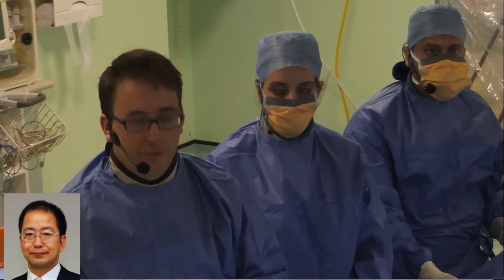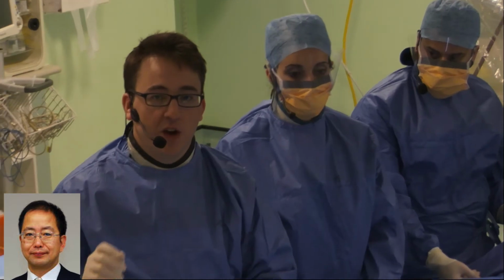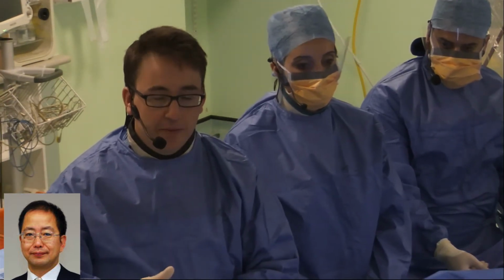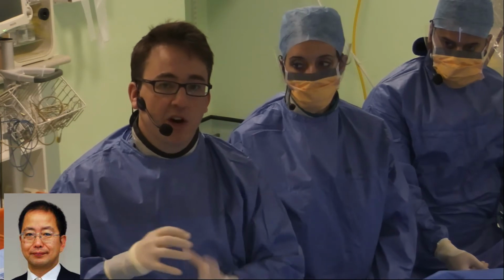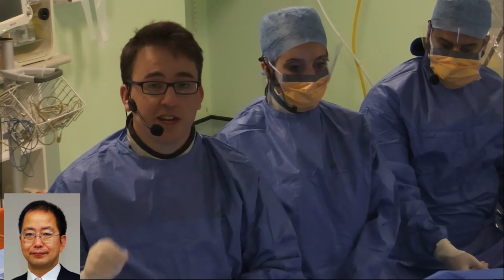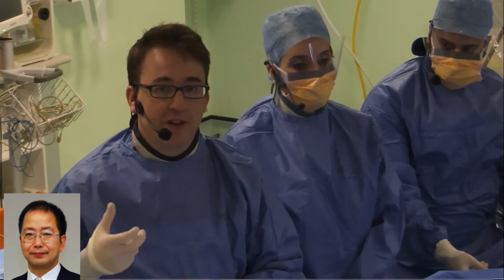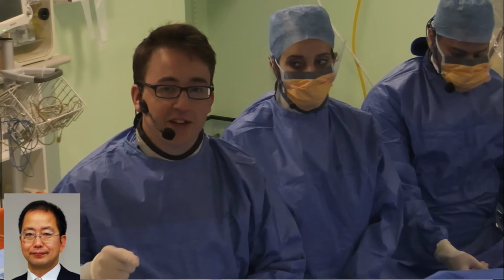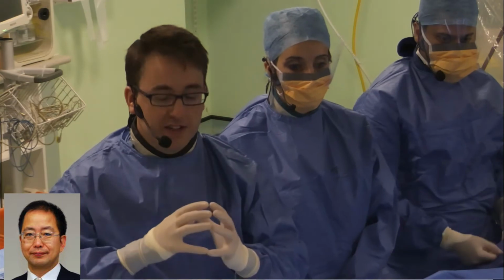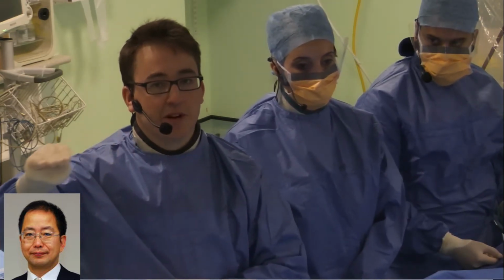We know from some work which has been done that the hyperemic effect of the nitrates takes about 30 seconds to peak. And then the epicardial effects probably take another 30 seconds before they're maximised. So if you were to leave the pressure wire down, measuring the IFR throughout, and then give the nitrates, the first thing you'd see is the IFR value would fall as you get mild hyperemia. But then as the epicardial vessel dilates, the IFR value rises and then stabilises.